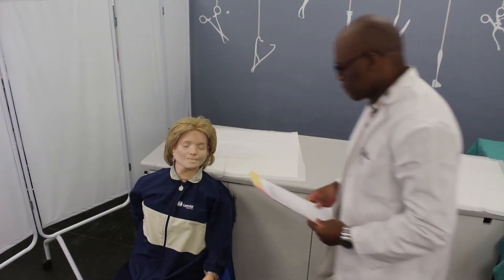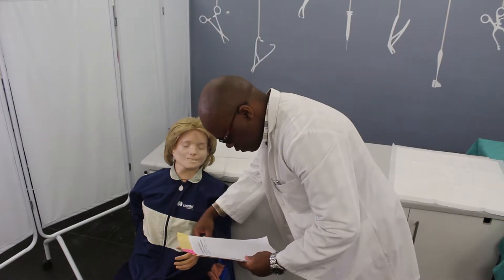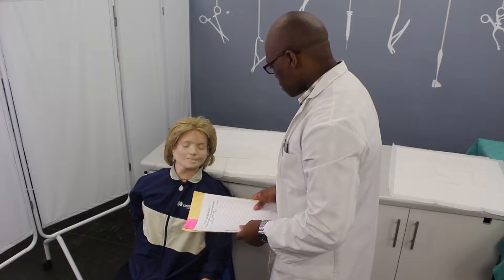Greet the patient and introduce yourself. Confirm the patient's identity by asking for his or her name and checking the armband. Explain the procedure and ask whether the patient has any allergies. Obtain verbal consent from the patient to perform the procedure.